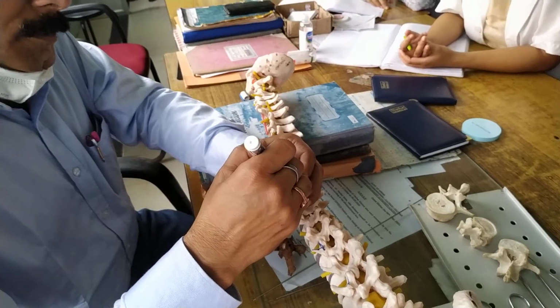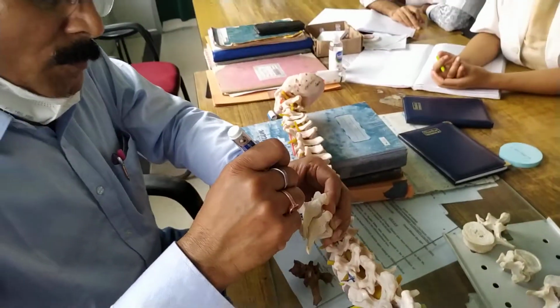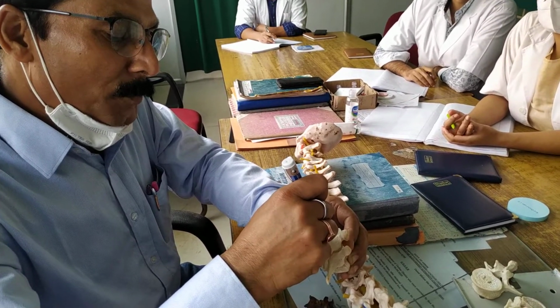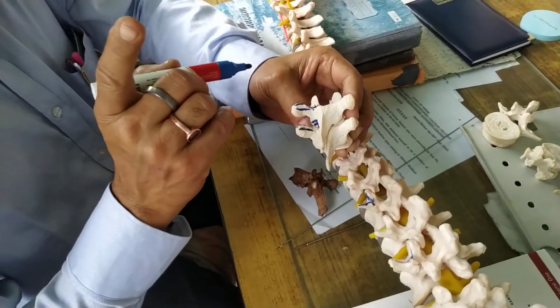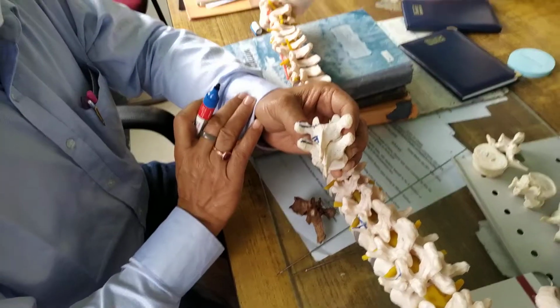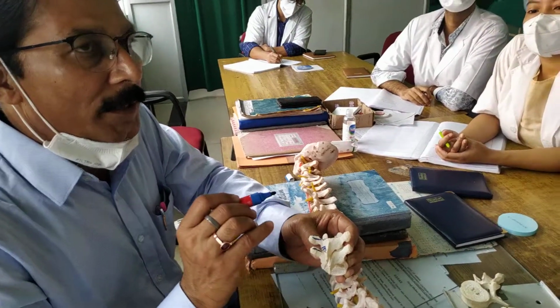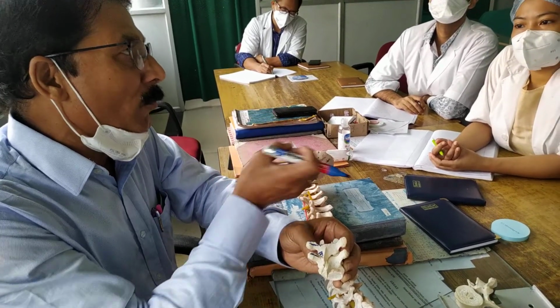See, you go like this, and this is the entry point. So for us, this is the midpoint of the superior articular surface of this vertebra. The superior articular surface is exposed by removing the inferior articular surface of the vertebra above.